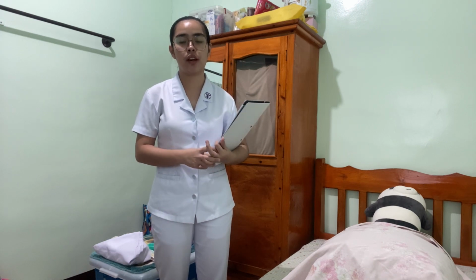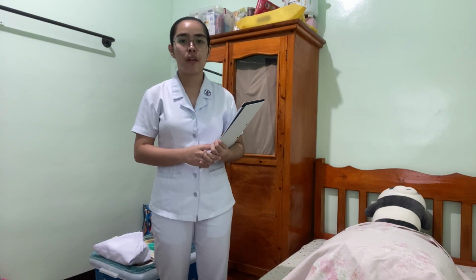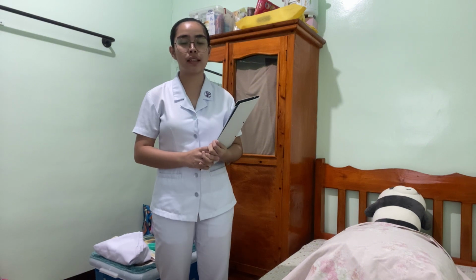Return demonstration. So urinary catheterization is the insertion of a flexible tube or the catheter through the urethra into the bladder to empty it of urine. So catheterization reduces the risk of infection and kidney damage by making sure that the bladder is empty either continuously or at regular intervals.